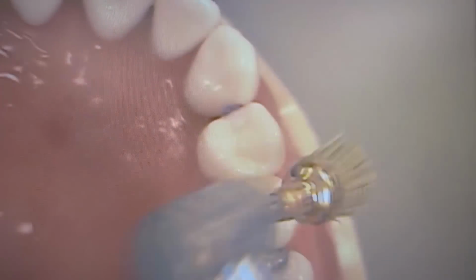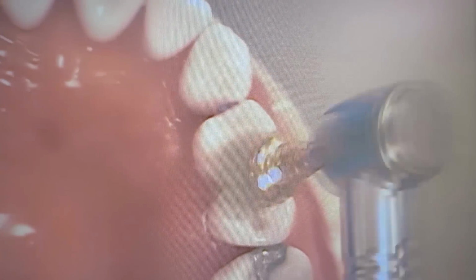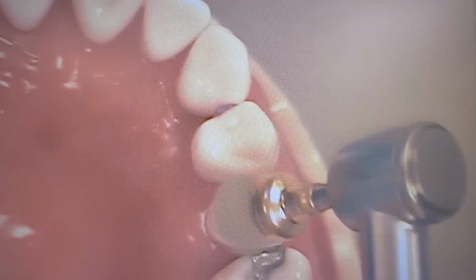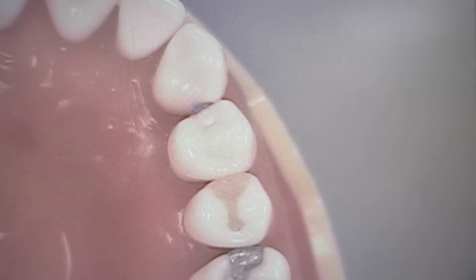Do you have your torque multiplier on? I do not. You're going to be using the torque multiplier. Okay. Well, it's okay. You only see the head part of it anyway. So yeah, you're fine. Just finish tapping, and that is the final product.